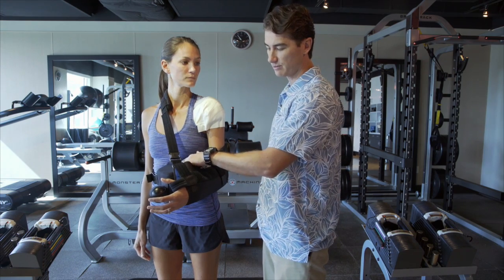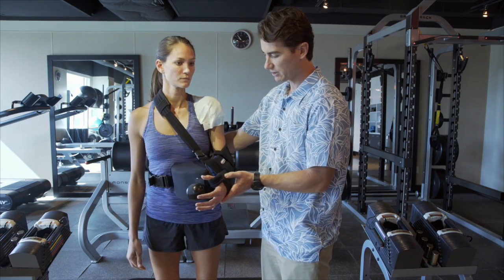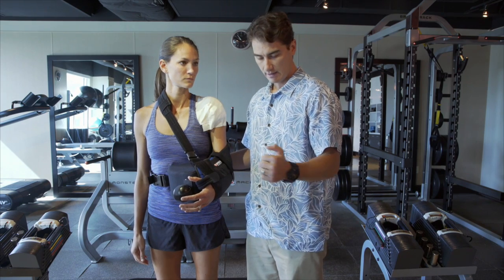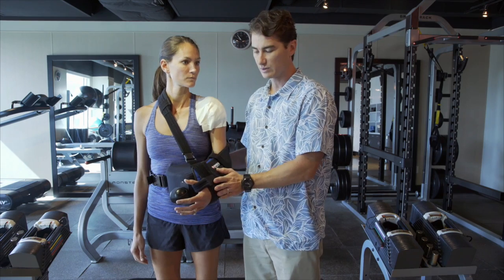You're going to wake up with this sort of brace on. This is called a neutral external rotation brace. The reason I like this brace is because it keeps your arm straight out this way. A lot of times after shoulder surgery you're going to get stiff, and I'd rather you get stiff out here as opposed to stiff in, which is why it's very important to use this pillow for about five or six weeks after surgery.